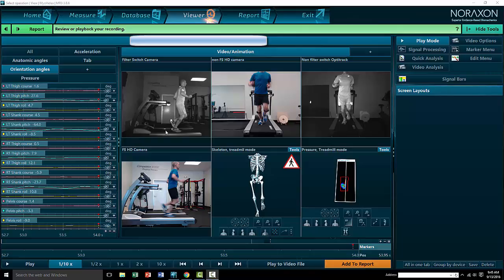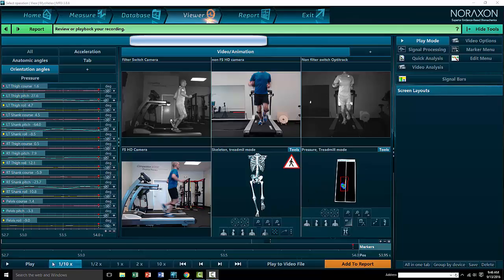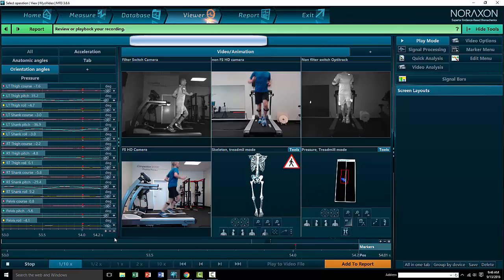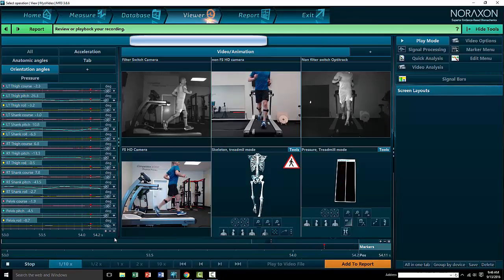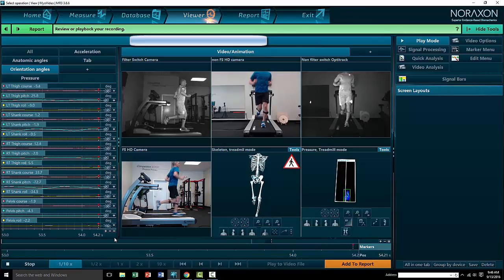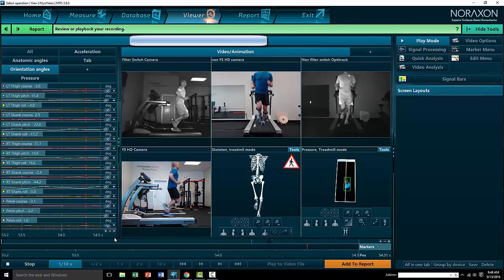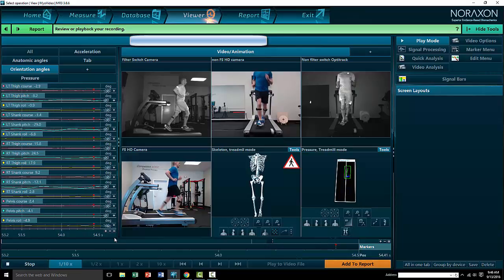What you also see is the grayscale high frame per second cameras and the color HD cameras, which shoot at 30 frames per second. You see the 3D skeletal avatar of this data here, and you see our pressure analysis. I'll run this through in slow motion so you can see exactly what we look at during the assessment.